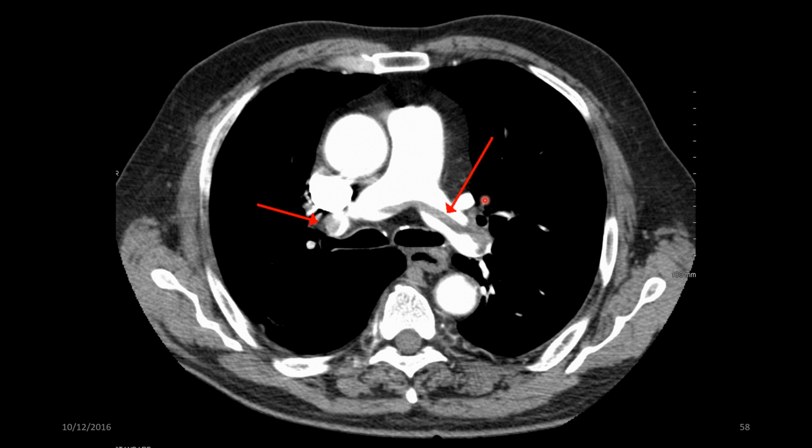So, any of you remember the thing about DVTs or deep vein thromboses and people on planes and getting home and then dying from them? This is what can happen. So, if you're wondering what the hell we're looking at, a slice taken through somebody's chest, what it is is a pulmonary embolus. So, I was mentioning DVT. So, DVT is a deep vein thrombosis. Usually, it originates from in your leg.